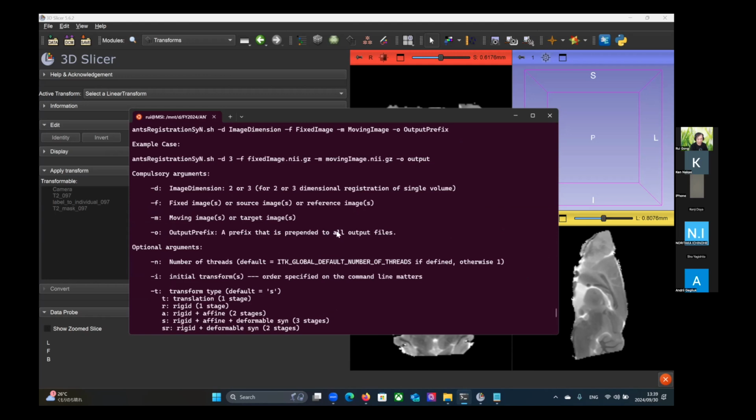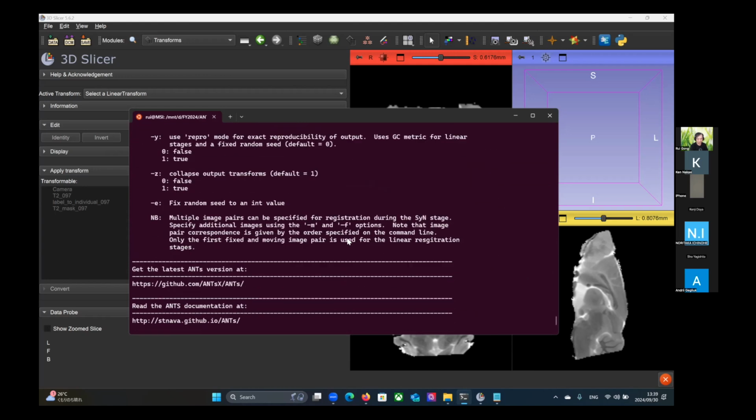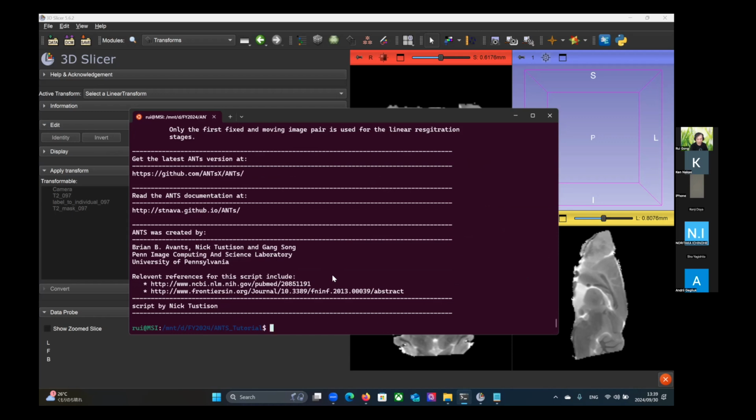In some cases it's better, but in some cases not, so you need to test. But if you want to provide an online system, this might not be the best one to use because it takes way too long. Makes sense. Thank you.